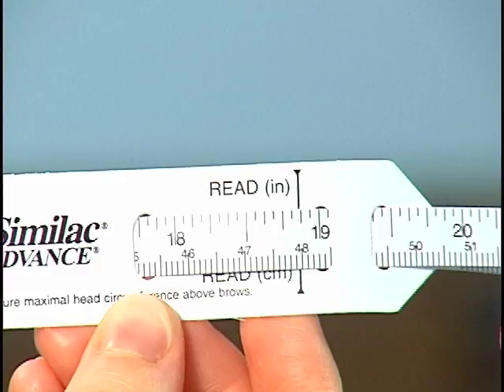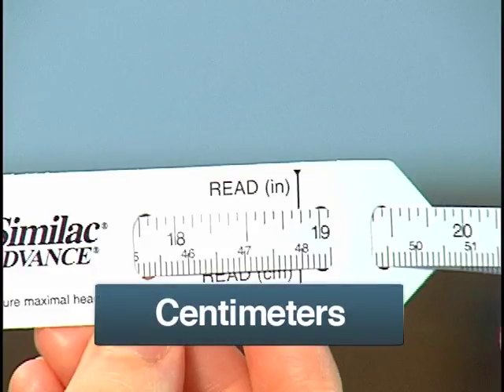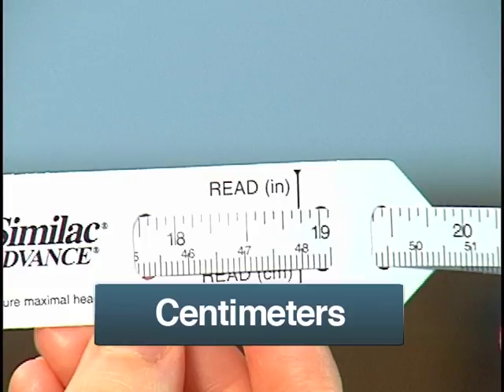As you can see, the top of the measuring band is calibrated in inches. These calibrations are farther apart. The bottom of the measuring band is calibrated in centimeters. These calibrations are closer together. The calibration you use to measure head circumference depends on your medical office policy. For this measurement, the medical assistant will use the centimeter calibrations.